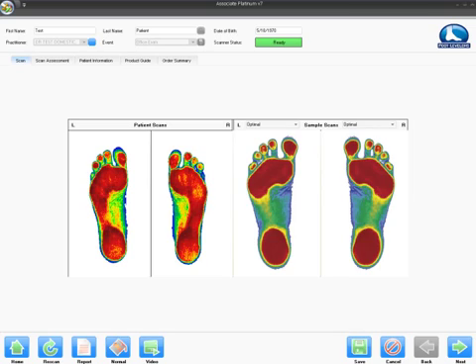Any yellow in the areas that should be red could be an indication of a callus formation. Calluses are stress reactions and do not blanch, so they will not present in a red color. From there we will discuss the three arches of the foot and how they relate to foot dysfunction.